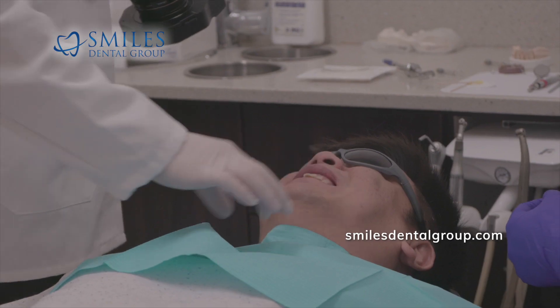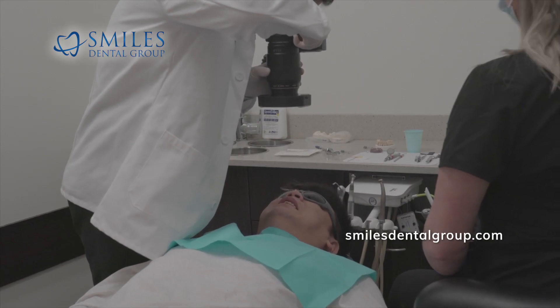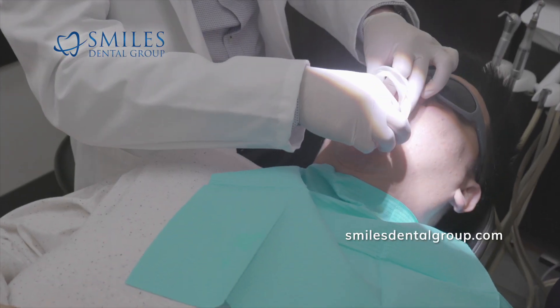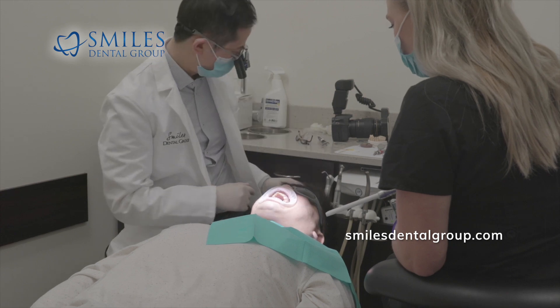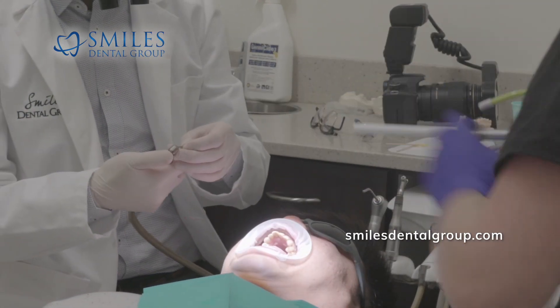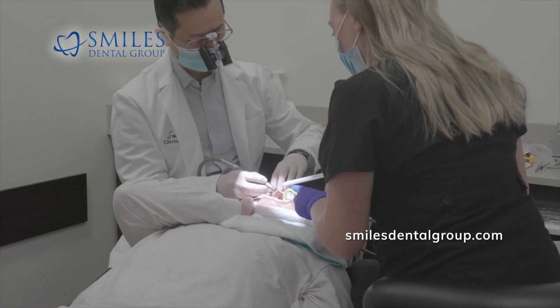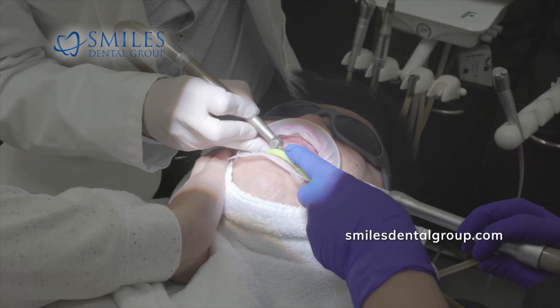I just finished freezing him and I'm taking some photos. We're using this single-use isolating device — a pretty useful device to keep the patient's lip and cheek away while we work. We use a lot of water so as not to heat up the teeth while we're working.